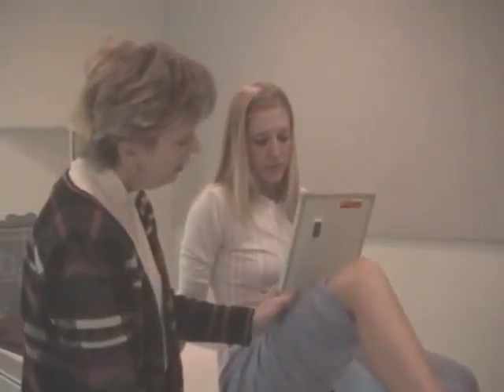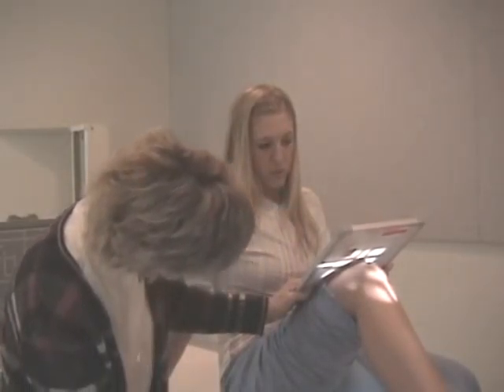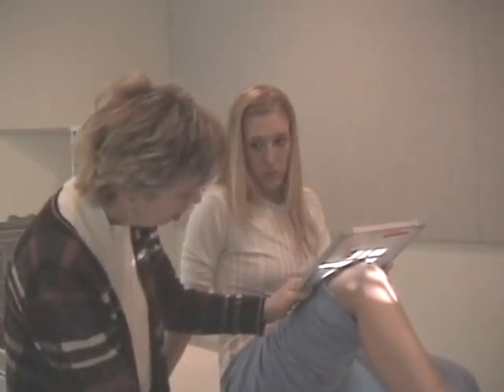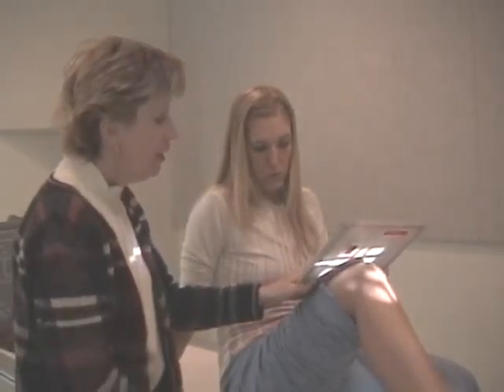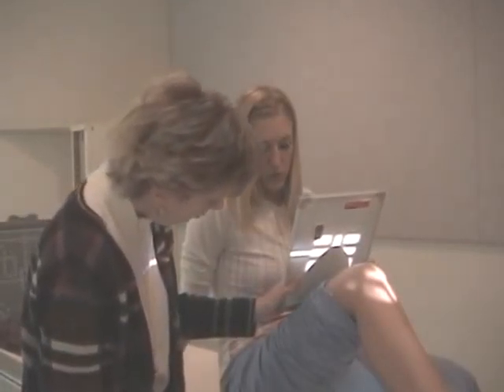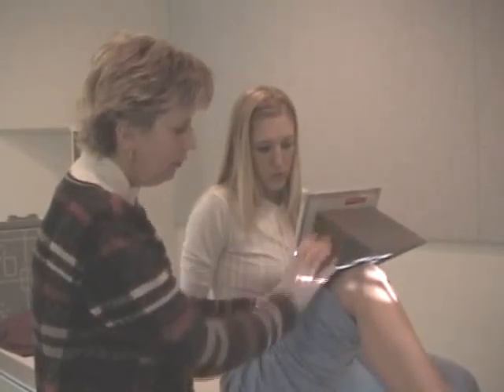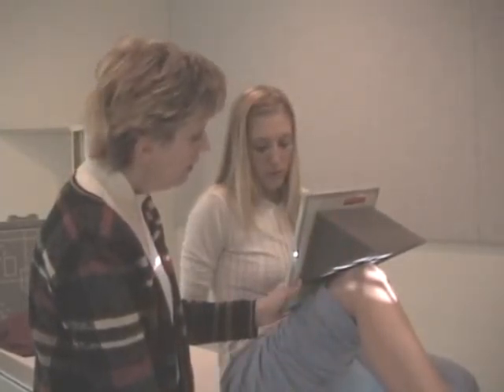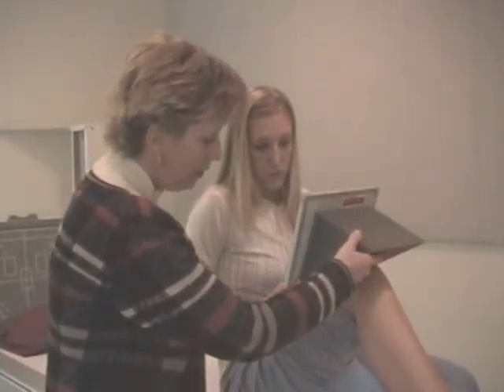You will see some techs just positioning like this. They'll do everything else that we talked about, but they'll have the cassette resting on the leg itself. There will be a little bit of elongation here, but it does produce a very diagnostic x-ray. Everything is perpendicular. The disadvantage is the OID, but you can compensate for that with increased SID. This is one way to do the patella. We will be back once we're set up for a second option to doing the patella.